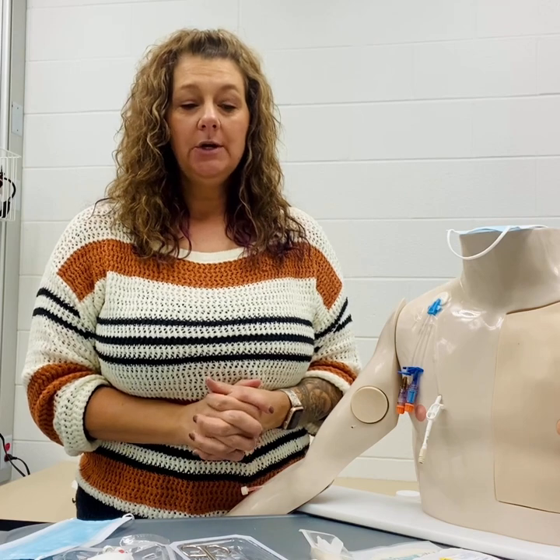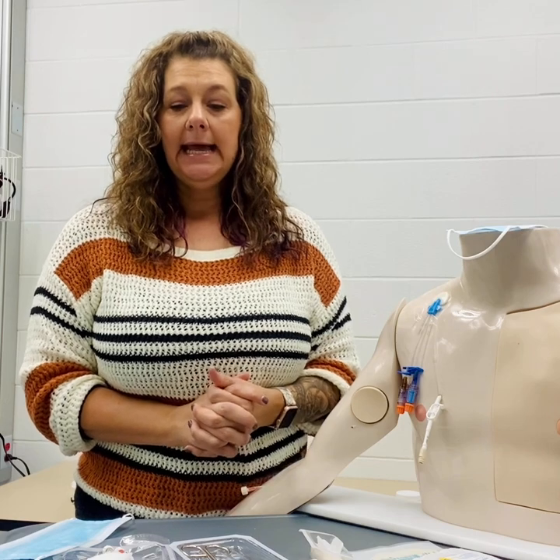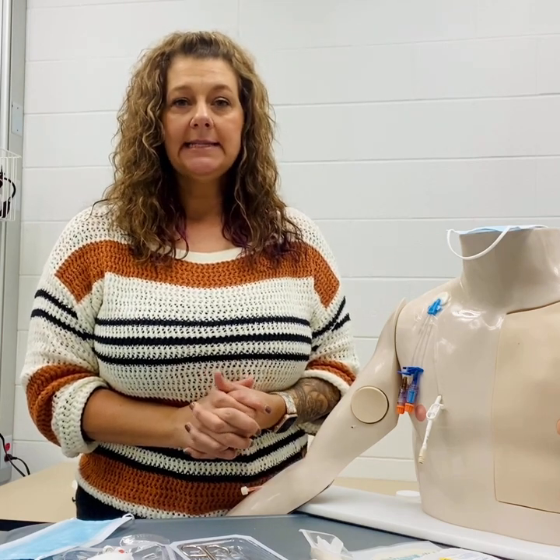Once we have completed the procedure, we'll clean up our area, wash our hands, ensure that the patient is comfortable and that their needs are met, and we will document how the patient tolerated the procedure, the appearance of the catheter, and any specific findings that we may have found during the procedure. And that is central line catheter removal.